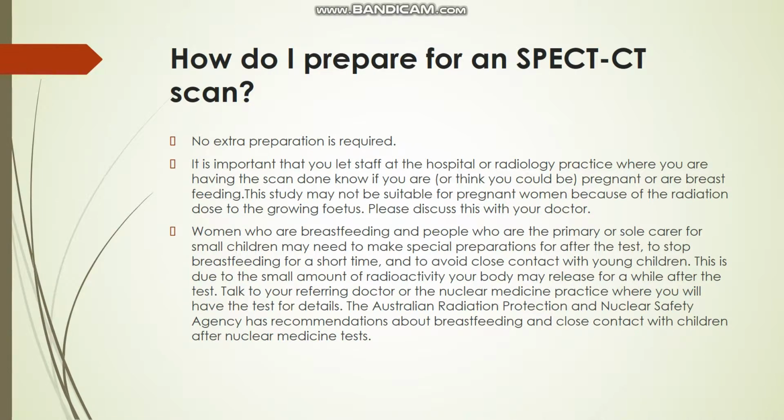No extra preparation is required. It's important that you let staff at the hospital or radiology practice where you're having the scan done know if you are or think you could be pregnant or are breastfeeding. This study may not be suitable for pregnant women because of the radiation dose to the growing fetus. Please discuss this with your doctor.